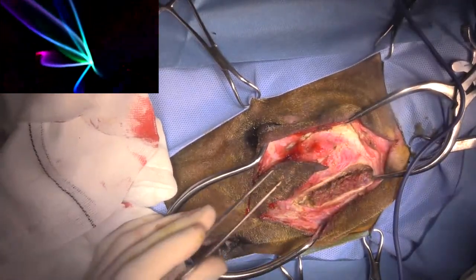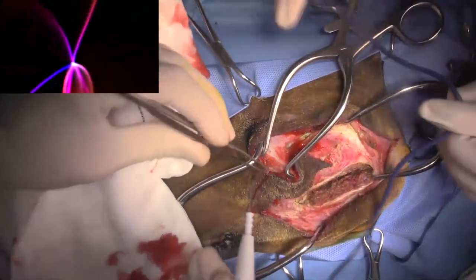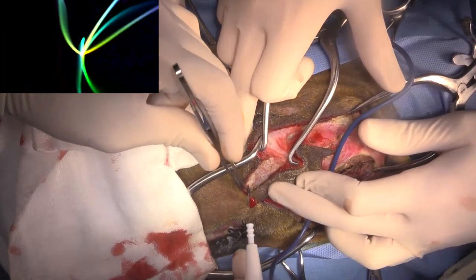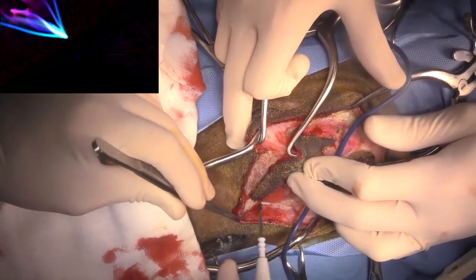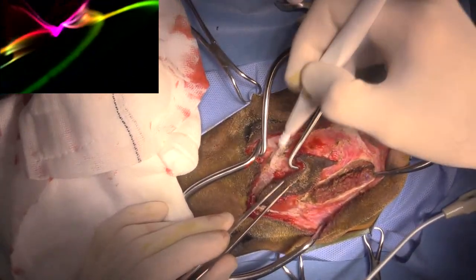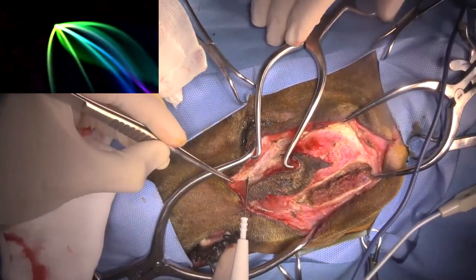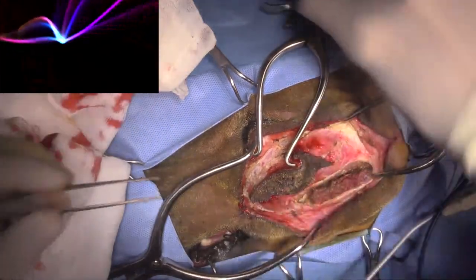If I can get something in here to try to spread those tissue planes apart a little bit. Thank you. You're going to want to be careful not to go too deep so that I don't penetrate into the tumor. For those of you joining us late, this is a fibrosarcoma in the zygomatic arch of a dog. We're doing a wide local excision, including removal. So it's a partial orbitectomy, partial maxillectomy. Get rid of this guy.